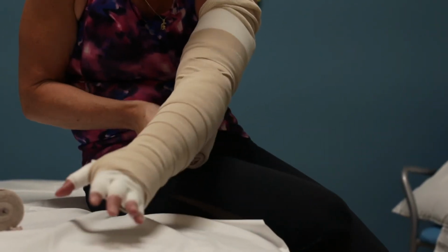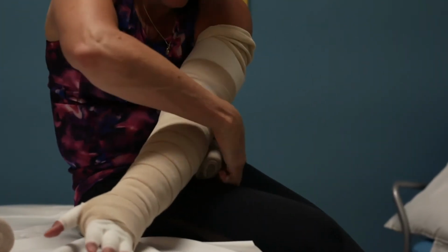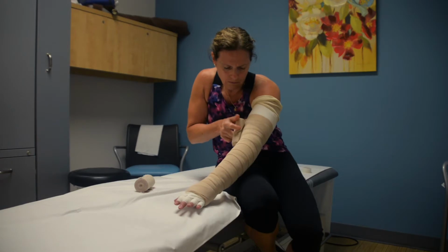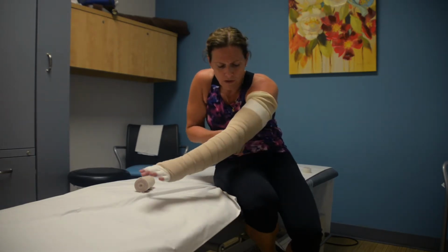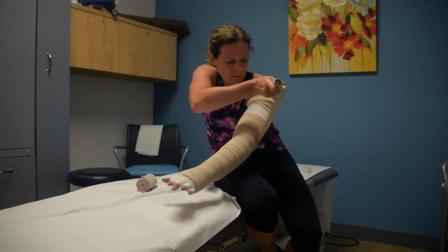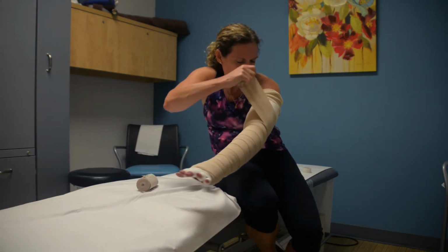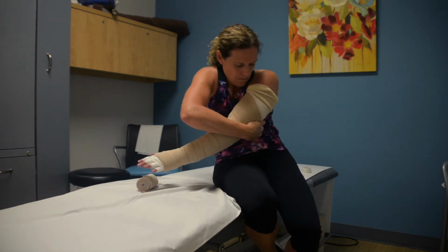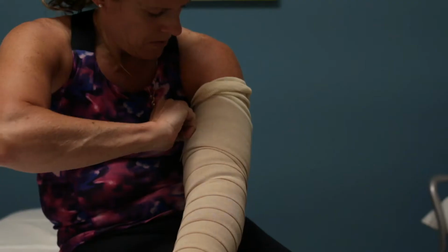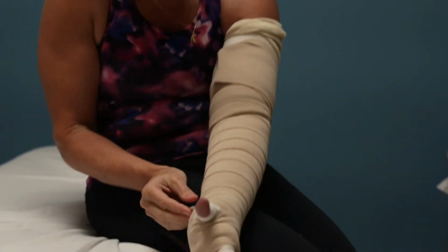So if you can, you want to keep your arm straight, especially as you get to the elbow and your upper arm. You also want to keep the amount of overlap consistent. Tuck it in or tape it. Like I said, sometimes I tape it. I have tape right here. So that's your third bandage.